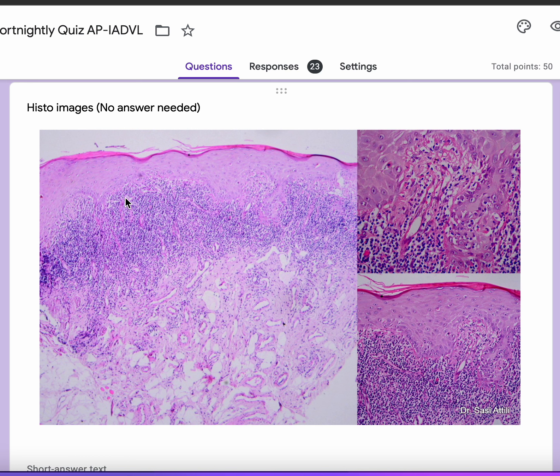There is clear-cut saw-toothing of the rete ridges. Can you see this saw-toothing? This is evident in the higher power image here. There is saw-toothing of the rete ridge, a band-like lymphocytic infiltrate, and some amount of compact hyperkeratosis on low power, which is obvious.